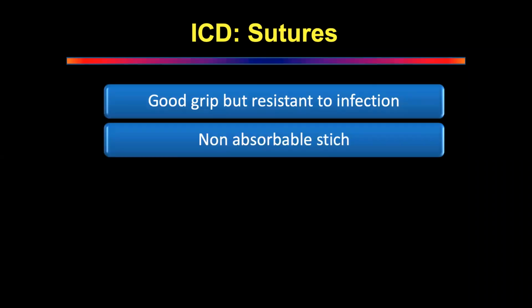If you're going to use it for an empyema drain, then ideally it should be non-absorbable monofilament. That is the key. If you're using it for a surgical drain which is going to come out in 1 day, it doesn't matter. You can use silk. But the philosophy of using a monofilament is that between the braided fibers of the multifilament, bugs can grow and you can get infection. So when you're using it in a long-term drain, it's better to use monofilament. If you're using it in a short-term drain for surgery, which is going to come out in 48 hours, it's okay to use silk. Do you understand that?